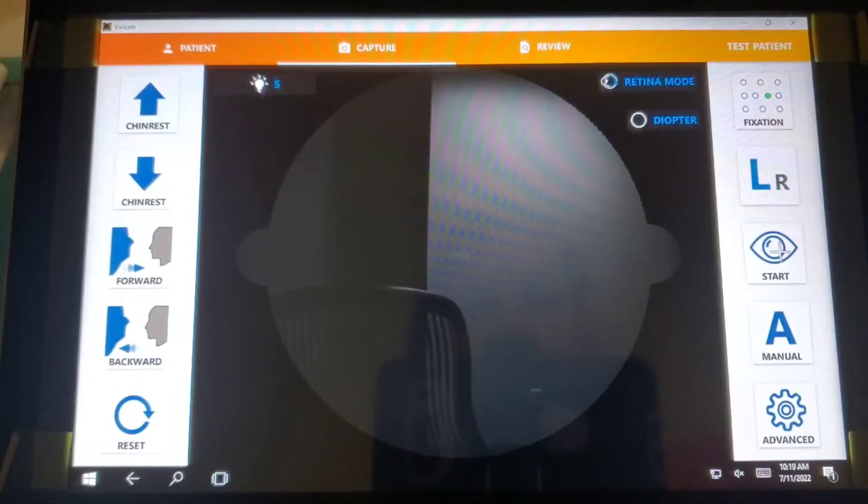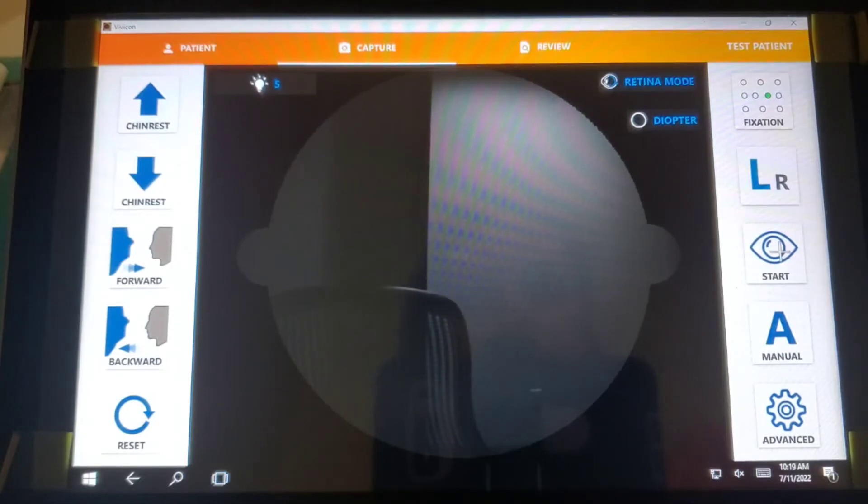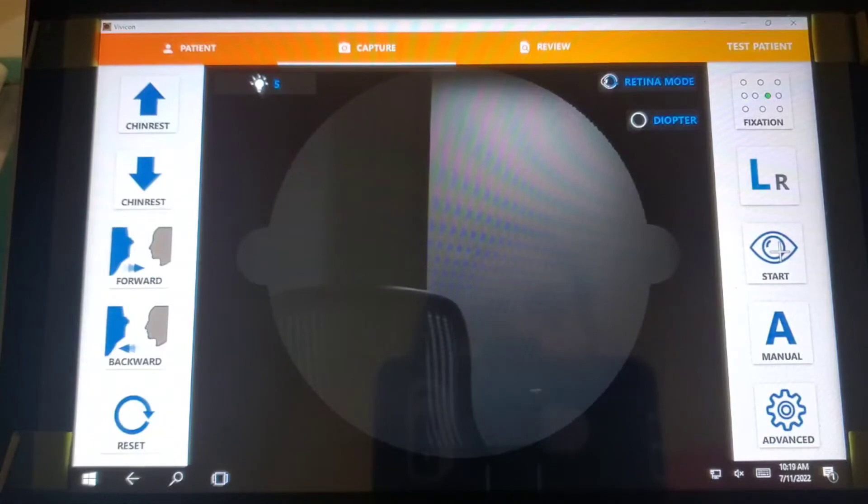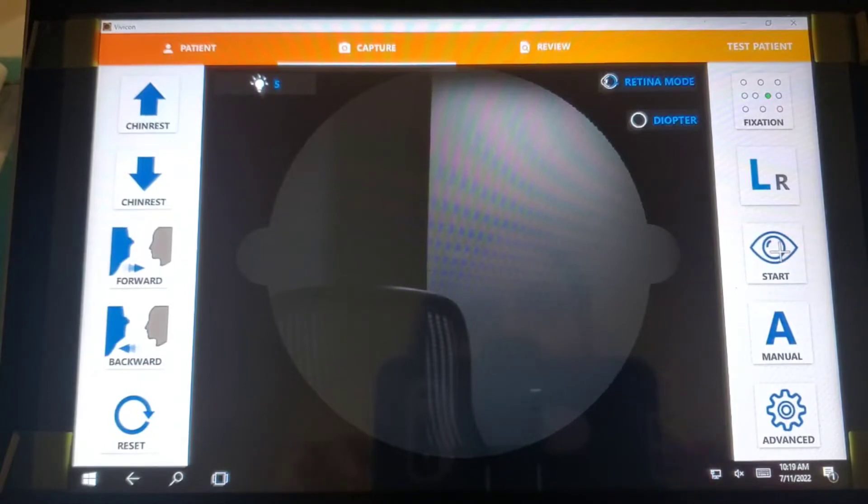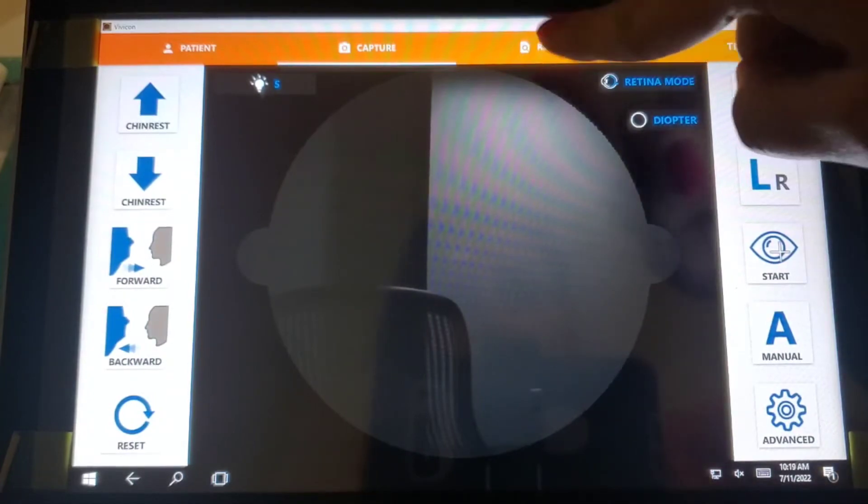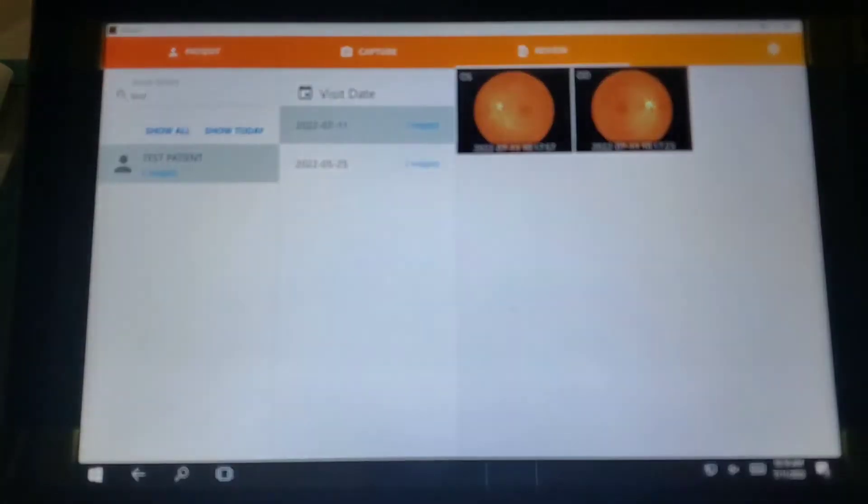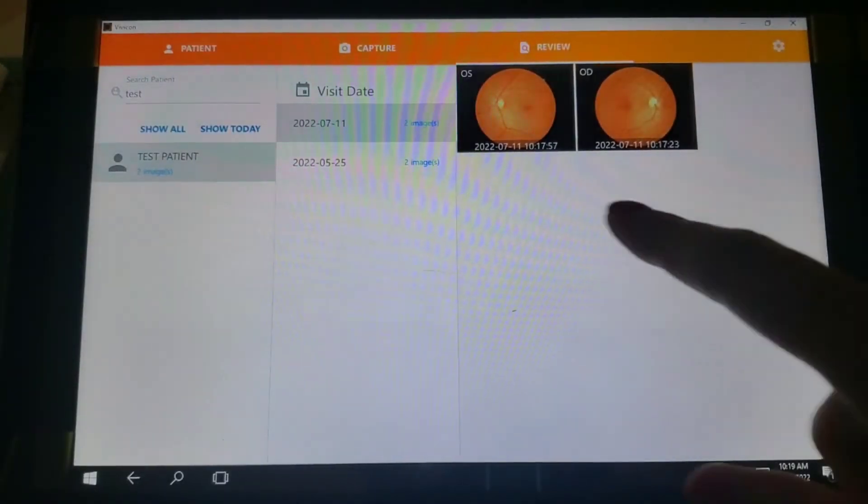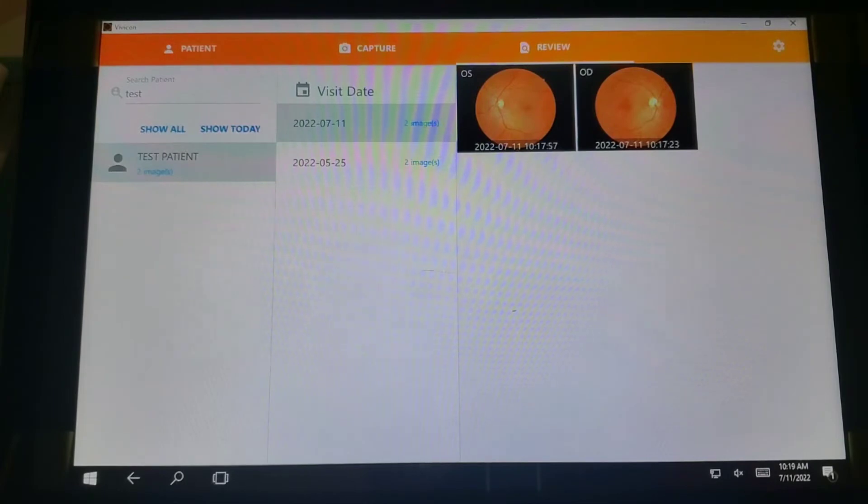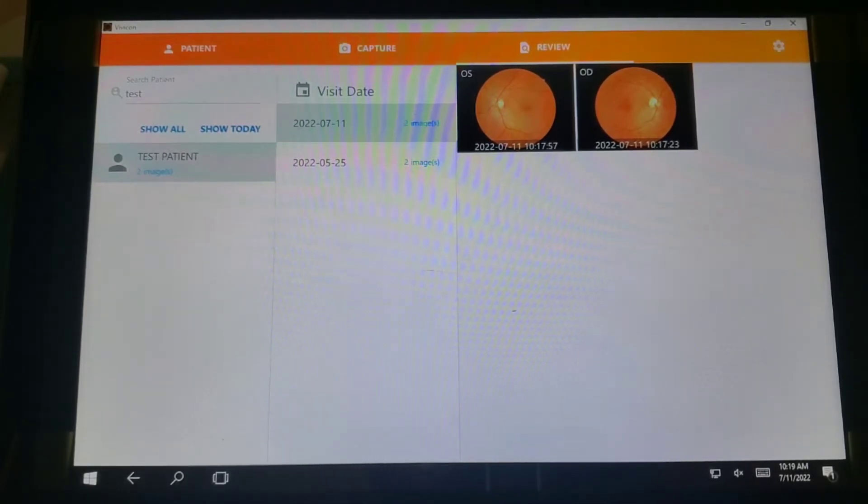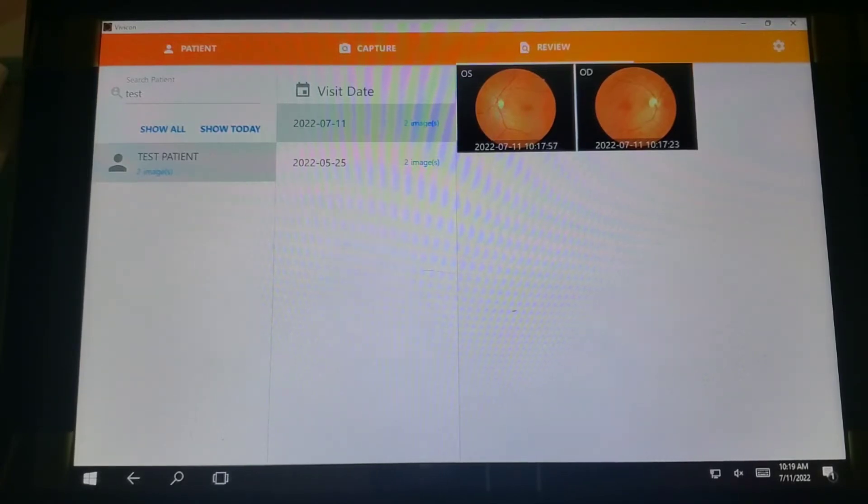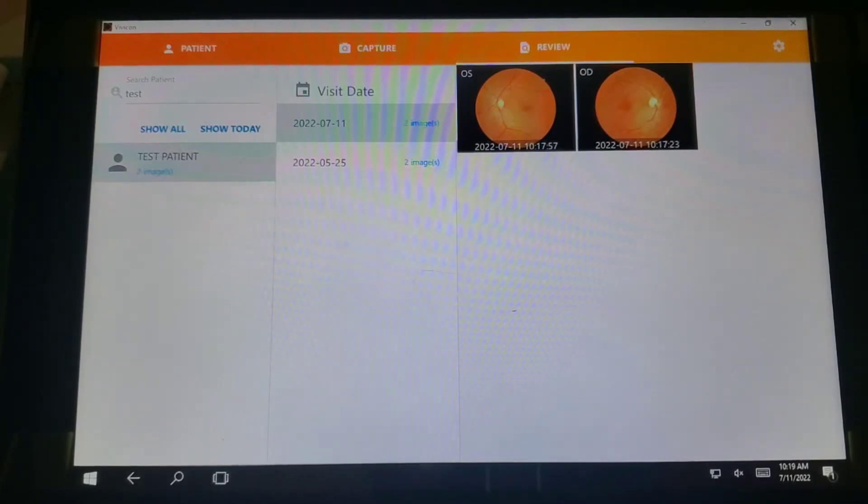After each photo is taken, it will pop up for a brief second to show you the picture. If you see that the patient blinked or that there's some eyelashes in the way, you can repeat it. But if you happen to miss that pop up really fast at the end, we are going to review the photos anyway. So we're going to click review. Then you can see both photos there. We don't see any eyelids that are in the way or any eyelashes, so those are good quality. We are going to keep those photos. But now we need to export them to the back computer. From the back computer, we'll upload them to the patient's chart.